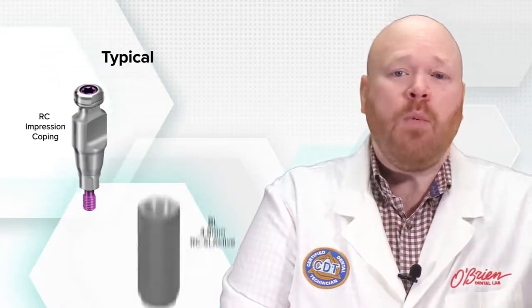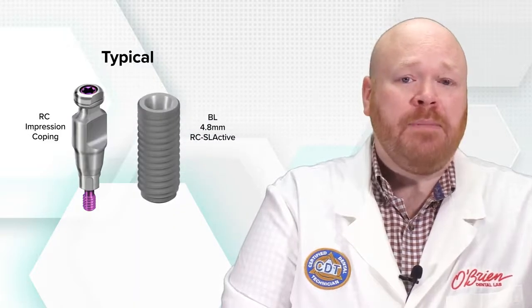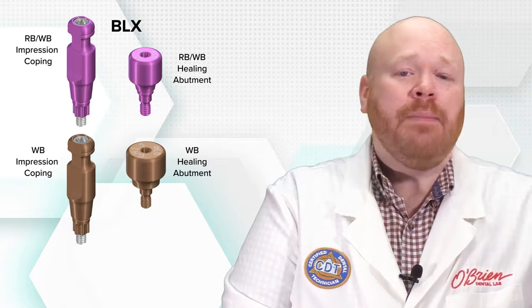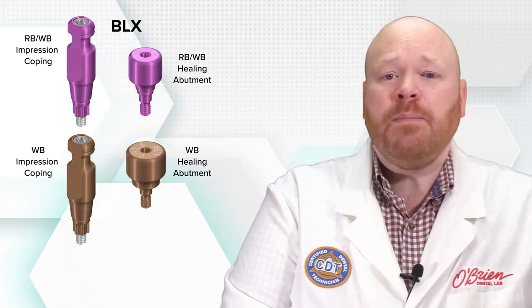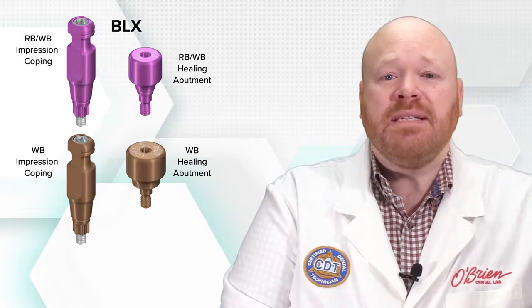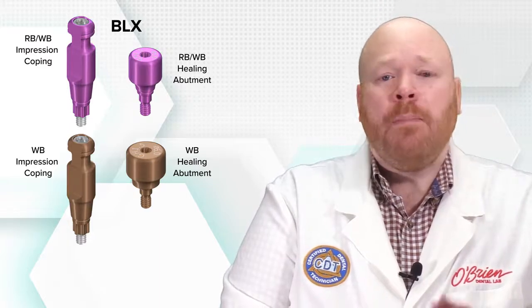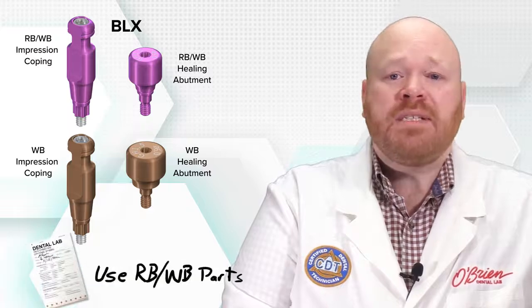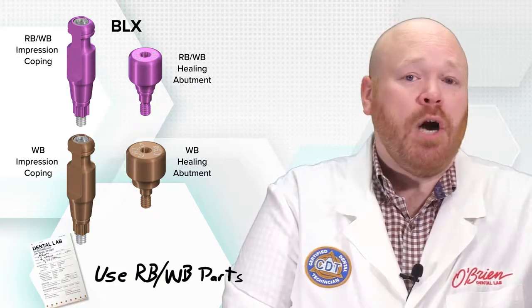So how is this prevented? Well, typically when you're ordering an impression coping, you get one that matches the platform size of the implant. But with BLX, the impression coping needs to match the healing abutment instead. Whether the implant is an RB or a WB doesn't really matter. What matters is the size of the healing abutment. But remember, the impression copings are exactly the same except for the color. So if you do find yourself with the wrong one, just make a note on the RX about what size parts should be used and you're good to go.